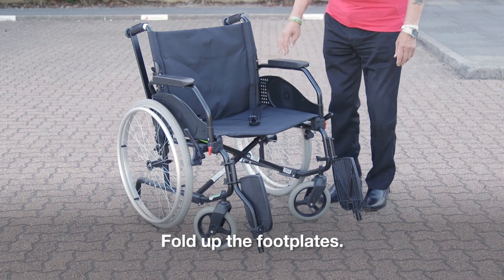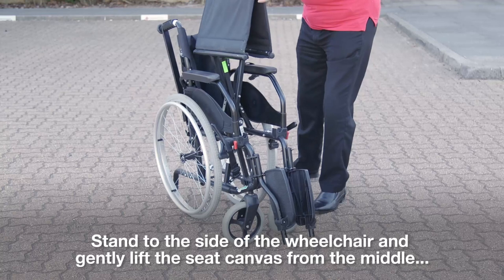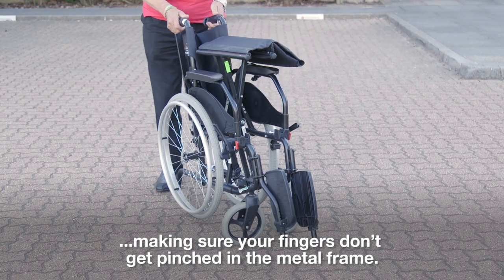Fold up the footplates. Stand to the side of the wheelchair and gently lift the seat canvas from the middle, making sure your fingers don't get pinched in the metal frame.